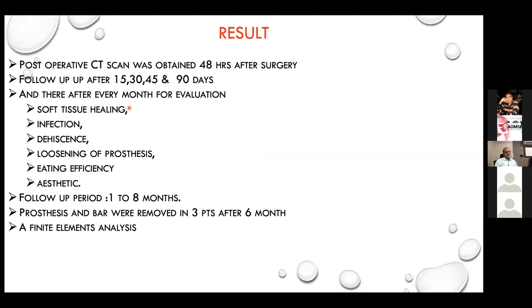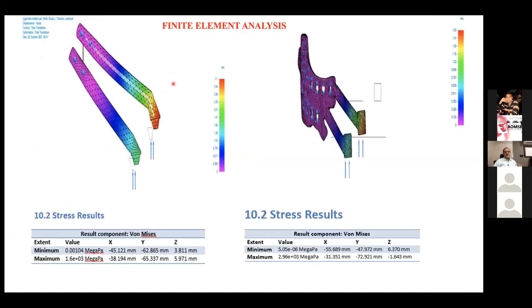And for the zygoma implant, finite element analysis was done to compare the force transmitted to this implant with the conventional zygoma, which has long-standing results. So what the result shows is that the force coming on the conventional zygoma, if it is placed in the ideal condition, is around 798 Newton, and the PSI gives around 799. So it is equal force.